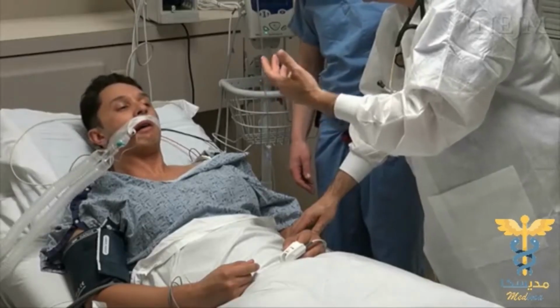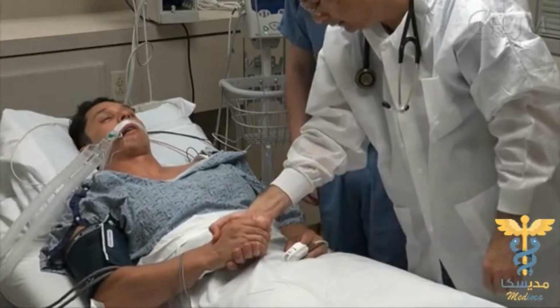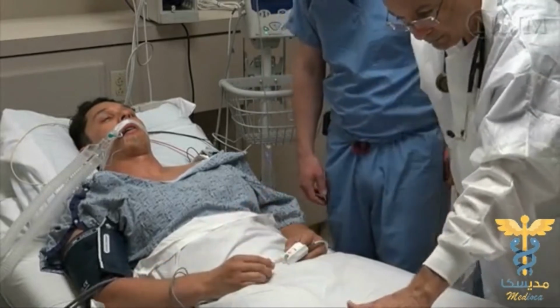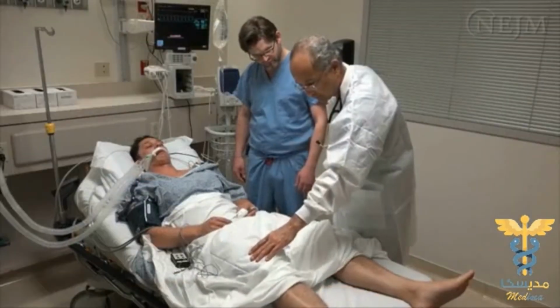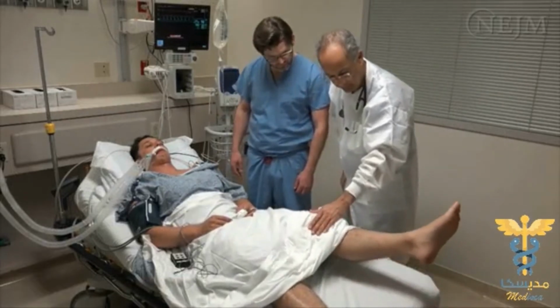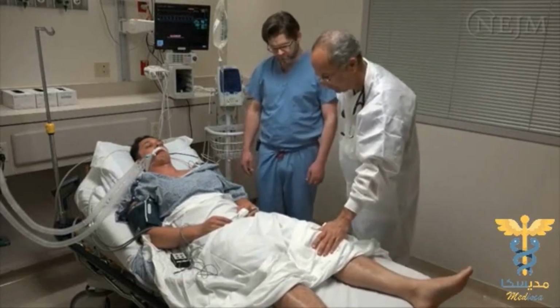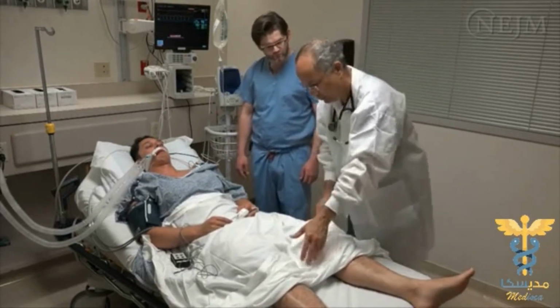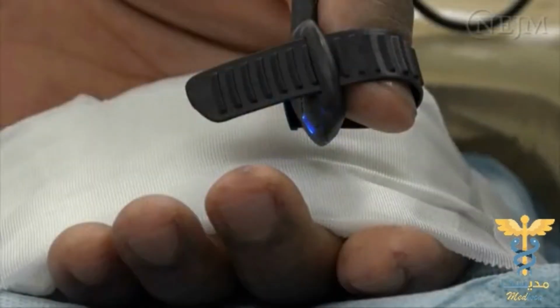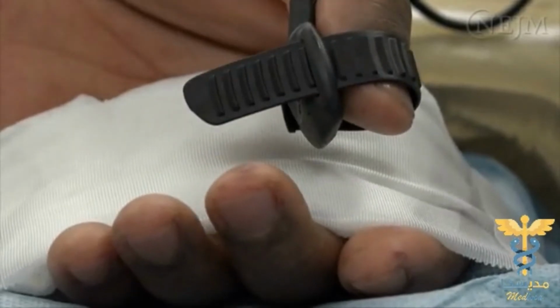Clinical tests such as grip strength, leg lift, and head lift are similarly inaccurate detectors of residual fade, yet they continue to be used. These clinical tests do not require sufficient muscle function to allow for the identification of residual neuromuscular weakness. Although these tests cannot rule out residual block, they can provide useful information in settings where more accurate monitors are unavailable. Objective evaluation involves recording, processing, and measuring muscle responses to nerve stimulation.